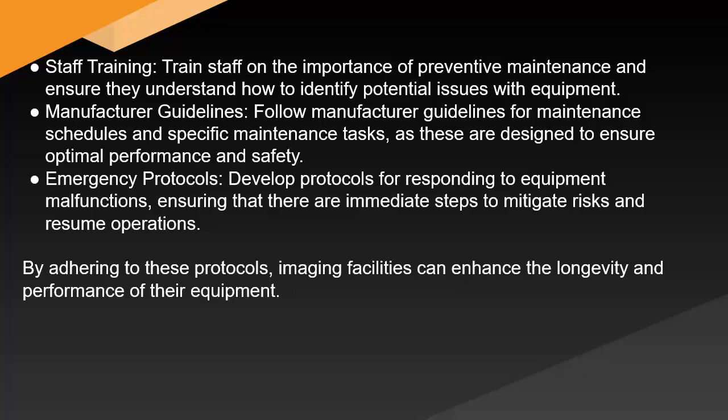performance and safety. Emergency protocols: develop protocols for responding to equipment malfunctions, ensuring that there are immediate steps to mitigate risks and resume operations. By adhering to these protocols, imaging facilities can enhance the longevity and performance of their equipment.